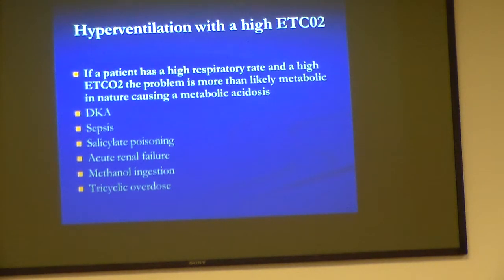I found that it's often more normal than you think it's going to be, which I think you guys are going to get into, normal readings when they shouldn't be normal. But this guy was higher, and he was hyperventilating as well. It was a good indication for the medic, who definitely put it in high gear: I thought this guy was sick, but he's way sicker than he may look at the present moment.